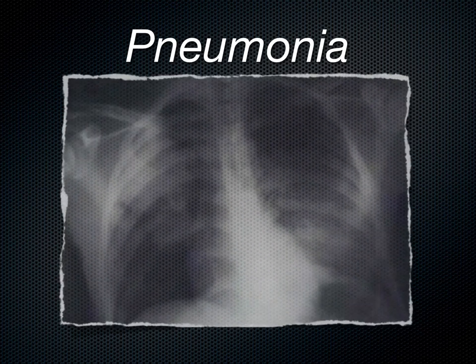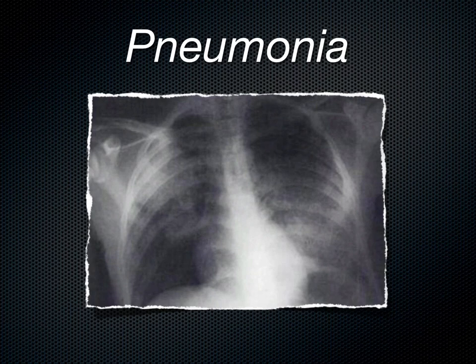Moving on to pneumonia. This is something that's been going on in Europe for years, the evaluation of parenchymal lung disease with ultrasound. And we're just now adopting this in the States and becoming more comfortable with the fact that chest x-ray is not the only test that we can use to determine position, location, extent of pneumonia.